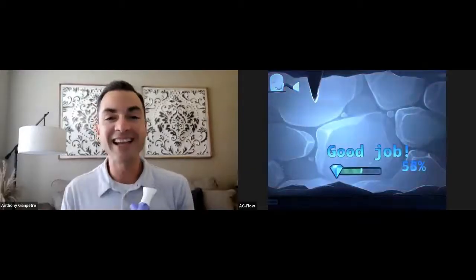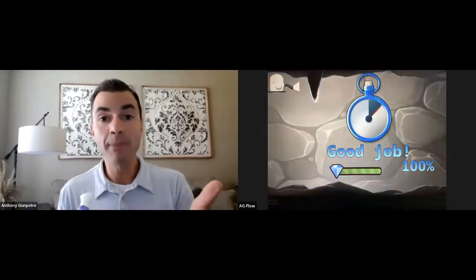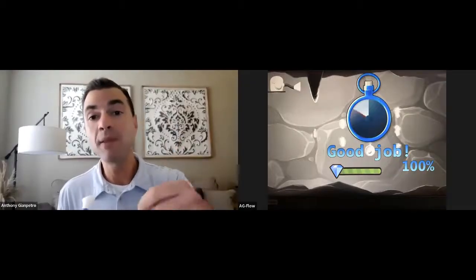Right? Whew. Okay, a little lightheaded there, right? Oh, I didn't get them all. You can see I just missed the end of that diamond, right? Now, that did allow me to meet the volume, and I did meet the minimum inspiratory pressure. However, blasting air in like that is not the purpose of what you would want to have happen with any spirometer use.